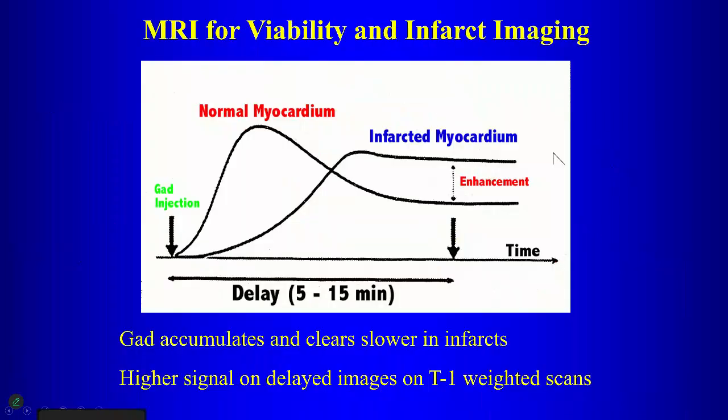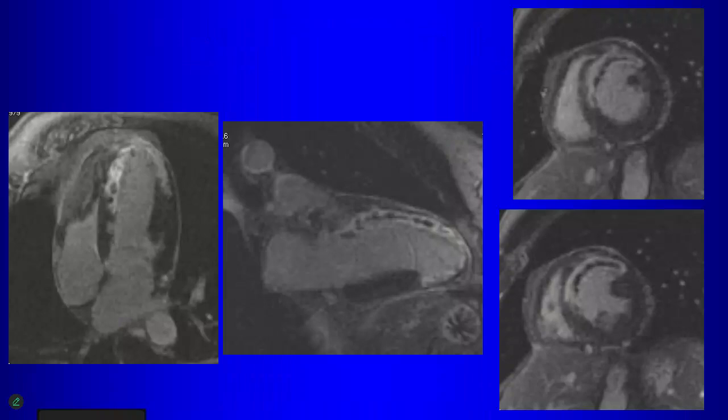So, yeah. Just a question on that, the delayed enhancement demonstration. The microvascular obstruction, that's the acute infarct part, but the delayed enhancement that happens in this case, is that just because, I guess the supply is slowed down, and then you have other, like... No, the delayed enhancement is from leakage of gadolinium because you have cell death.